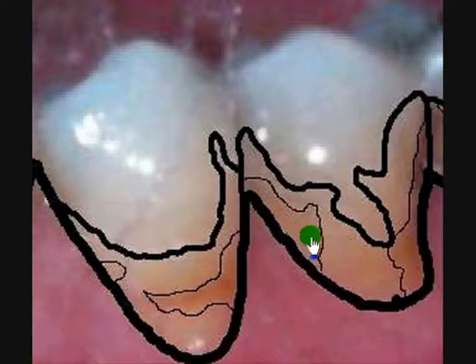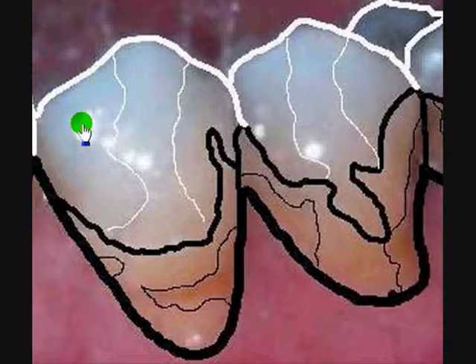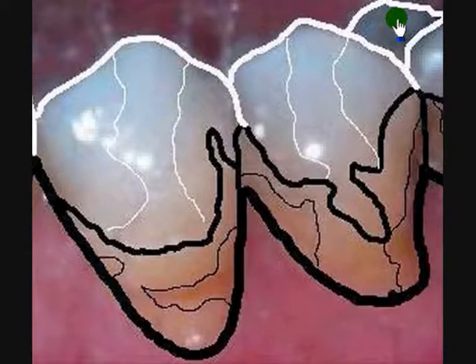Besides giving a map of the body compared to the enamel, the enamel itself is also being mapped, because there are areas of darker enamels, like these two lobes here and these lobes, and even back here this lingual cusp of this molar is quite dark, but it's also affected by the inside shadow of the mouth.